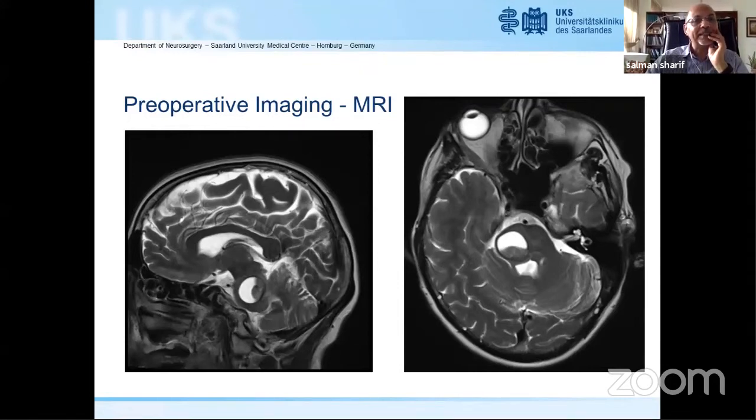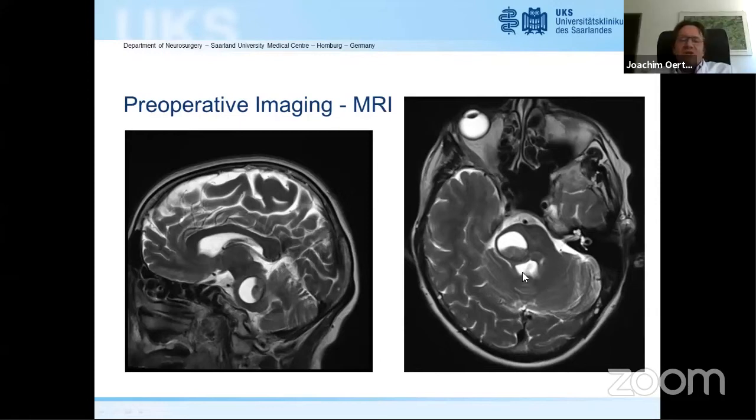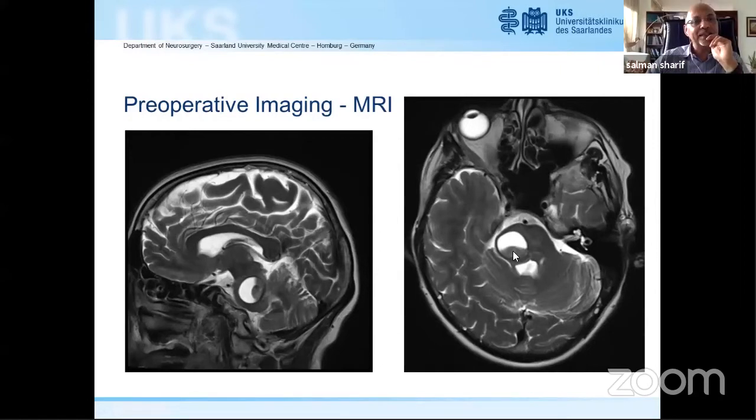Okay, we have Hafiz Neymar again. Cavernoma. Yes, cavernoma. Cavernoma with a hemorrhage? Yes. I think it's a good option. We have another person here, so let's see what he has to say.